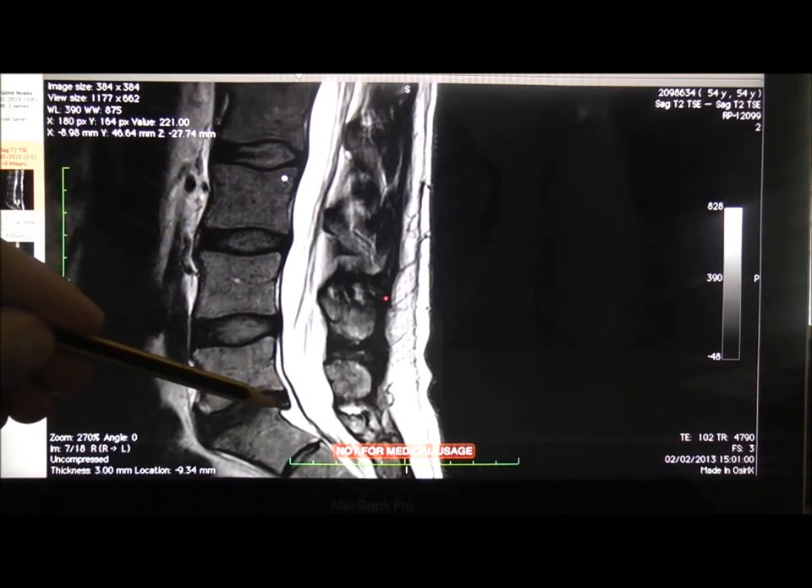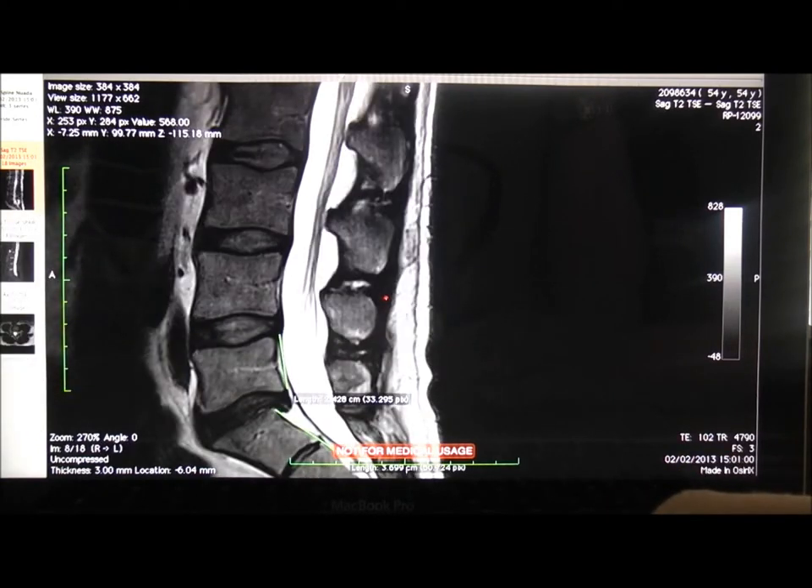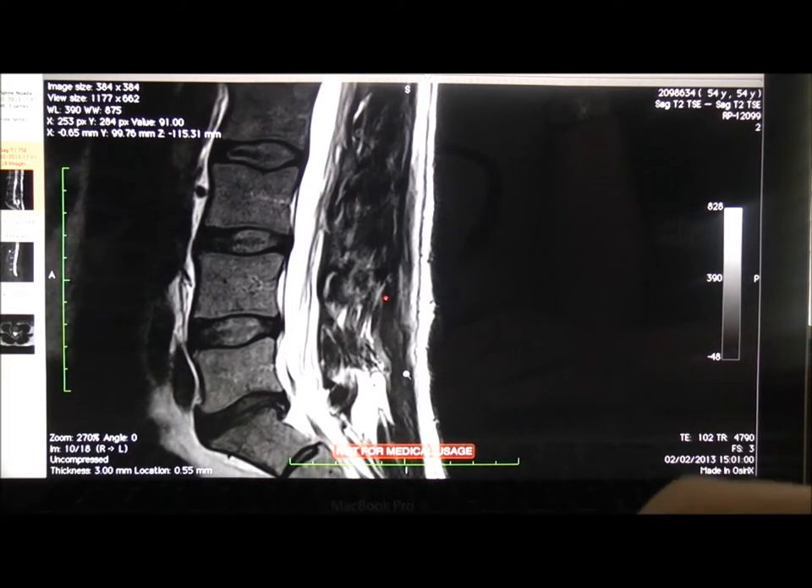You can see this high intensity zone, which means a little bit of a posterior disc tear. Standard physical therapy treatment for that might be core stability exercises. We might also want to try this patient on some IDD therapy and various other modalities.